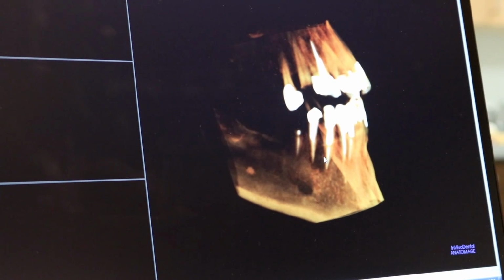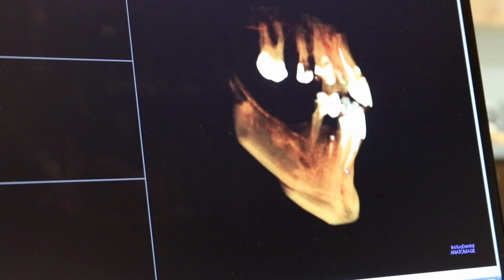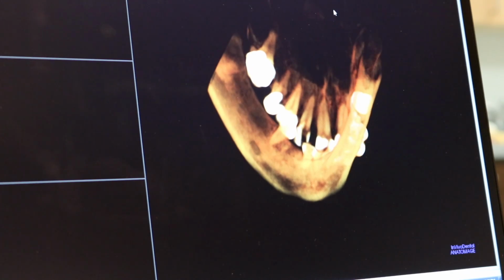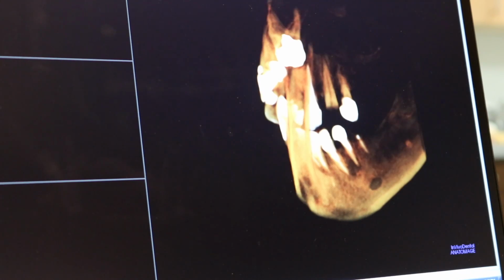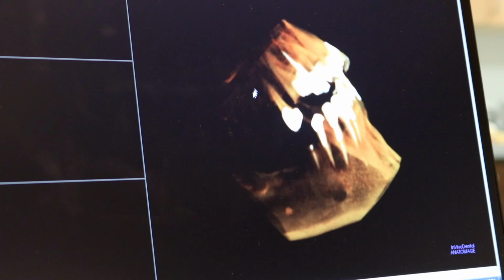This here is our CT, or some people call it CBCT. It's basically a cone beam, a CAT scan image, a 3-dimensional image of the jaw. What this allows us to do is see depth versus just 2 dimensions. So with just one x-ray, we can rotate all around. I can see the jaw from the front, from behind, upside down. You can see up into the sinuses here, versus in the old days we couldn't see any of that. We could only see in 2 dimensions. If there's pathology in the jaws, anything like that, we can more easily pick it up on here.